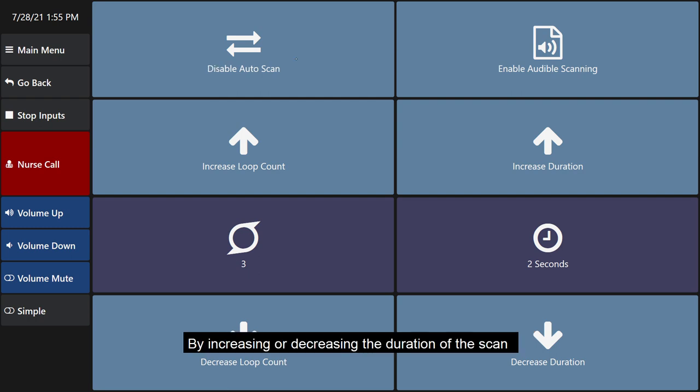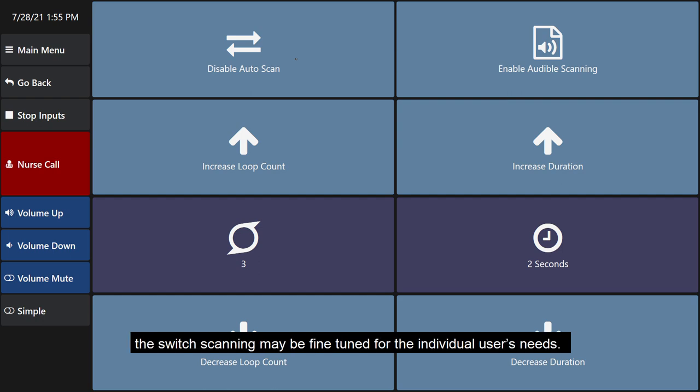By increasing or decreasing the duration of the scan, the switch scanning may be fine-tuned for the individual user's needs.